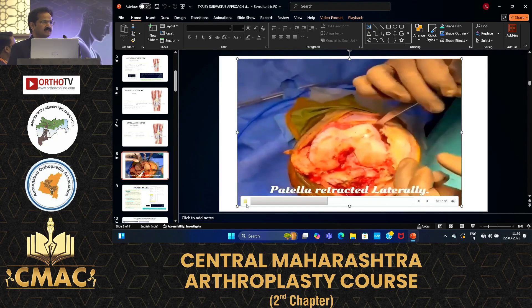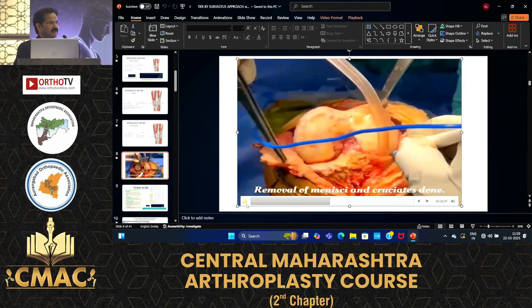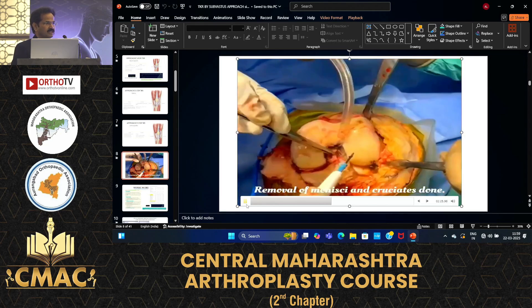Here is the knee in front of you. Without disturbing the quadriceps you are directly on the knee joint.